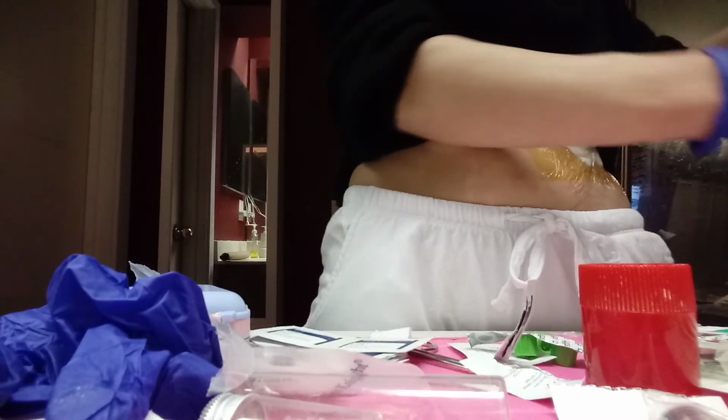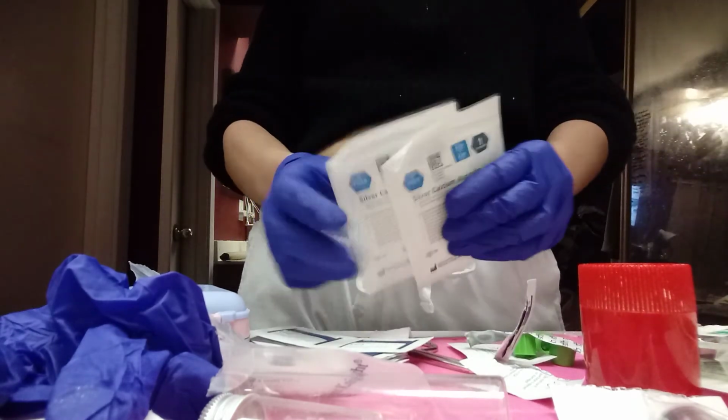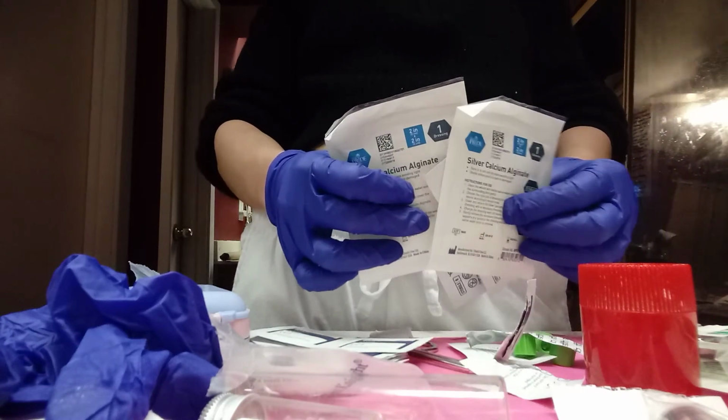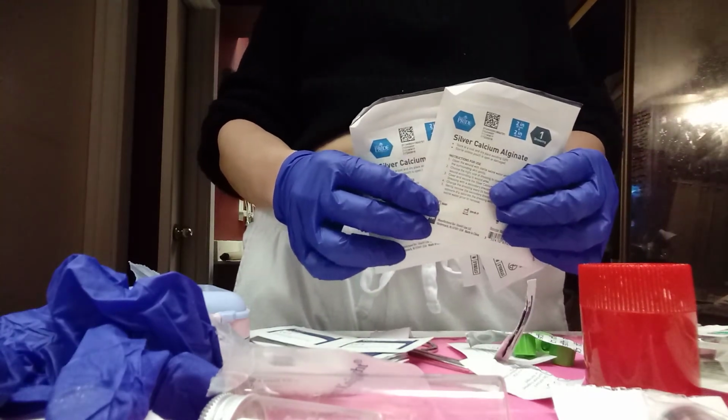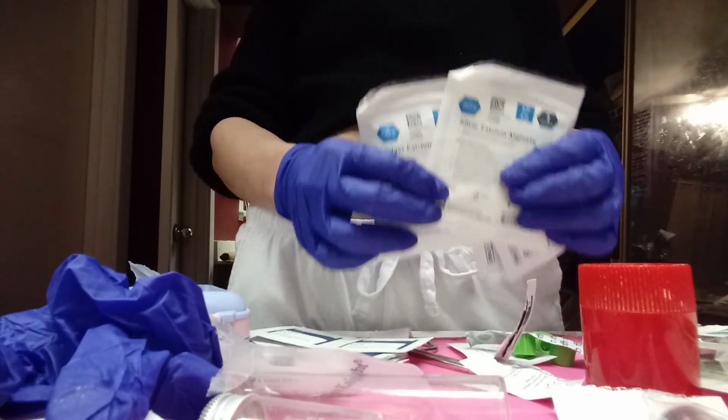Hand sanitizer, really important. And another important thing is to bring gauze with you. And then bring some dressings that you know will work. I'm allergic to ChloraPrep and chlorhexidine, so I had to buy these silver alginate dressings, which actually work a lot better, which I found on Amazon.